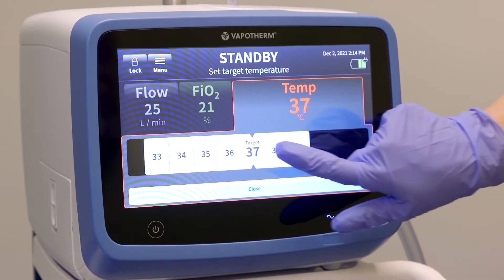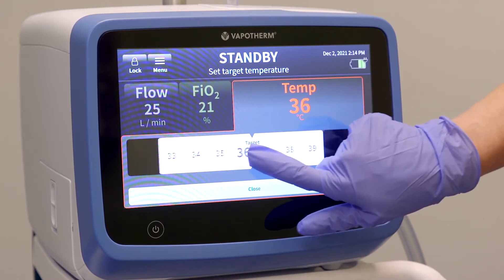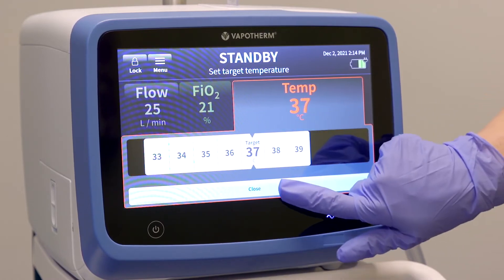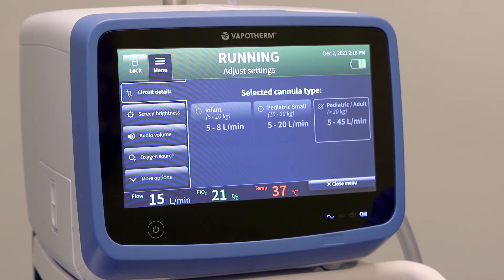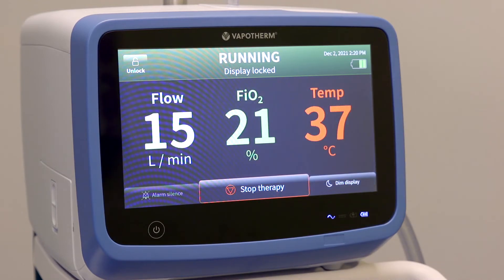The HVT 2.0 uses touch screen operation that can be controlled with wet or dry, gloved or ungloved hands. A settings menu accessible at the top left includes selections such as screen brightness and oxygen source. In addition to the three parameter settings of flow, FiO2, and temperature, the display also includes an alarm silence button and screen dim.